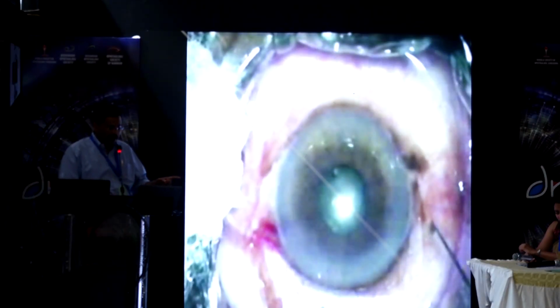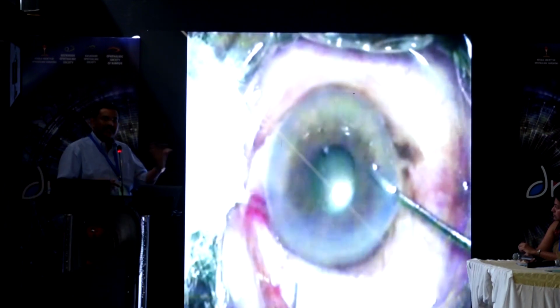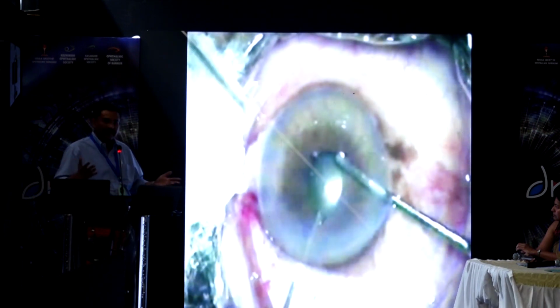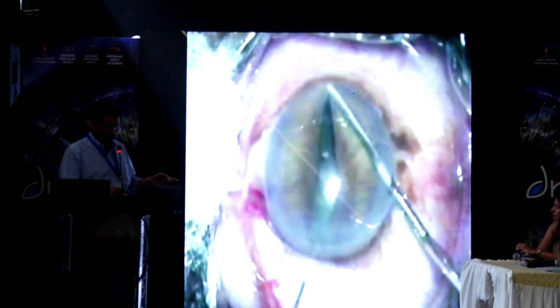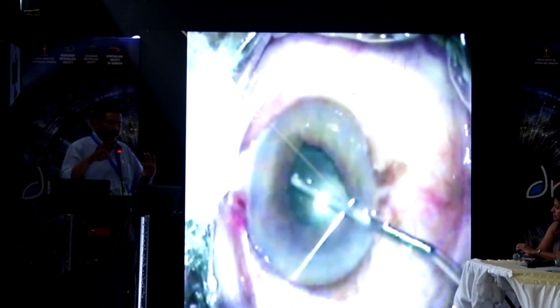So this is another typical black cataract which I was showing. First itself I decided to do SICS. Sometimes there is no point in trying to do phaco. Here again it stretches so nicely, and SICS is good. Before this one also you can do an SICS. You can do a can-opener capsulotomy underneath the pupil also. Now I have stopped all those.